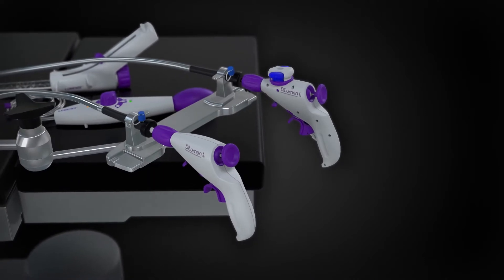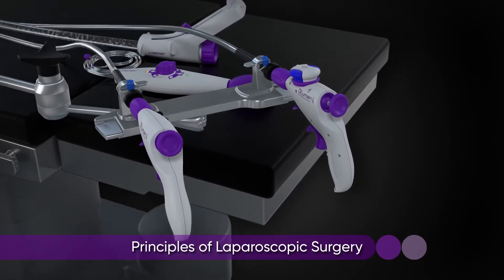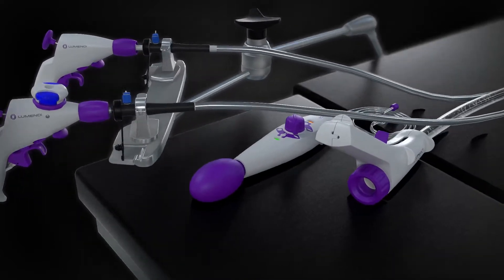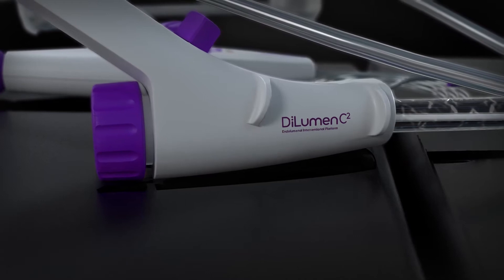After several years of development, Lumendi has successfully merged the principles of laparoscopic surgery, instrument triangulation, tissue retraction, and dissection with the benefits of flexible endoscopy. This new evolution in patient care is called DiLumen C2.